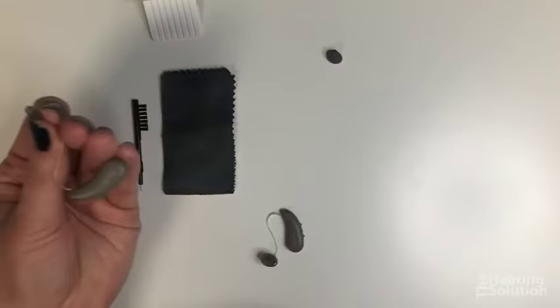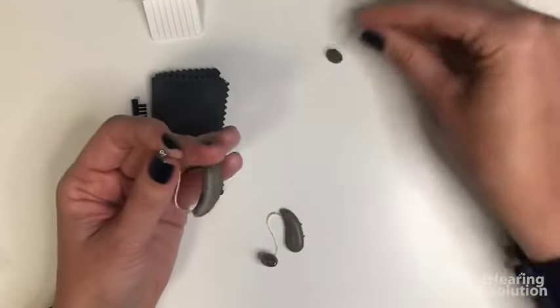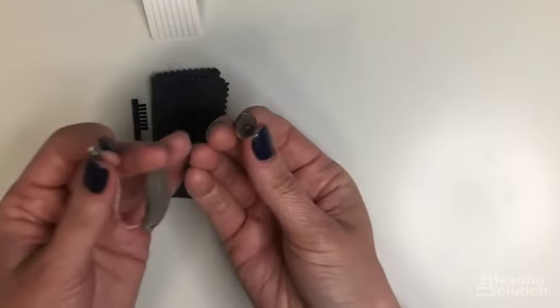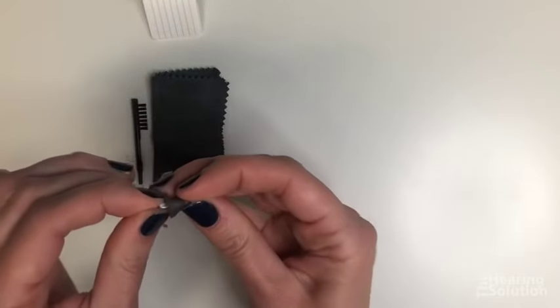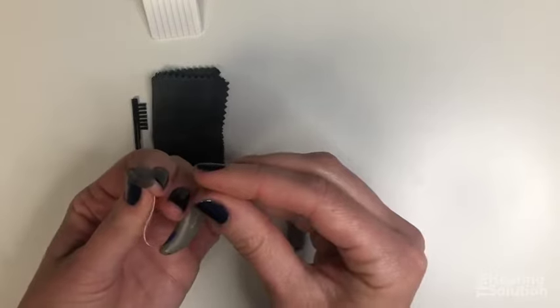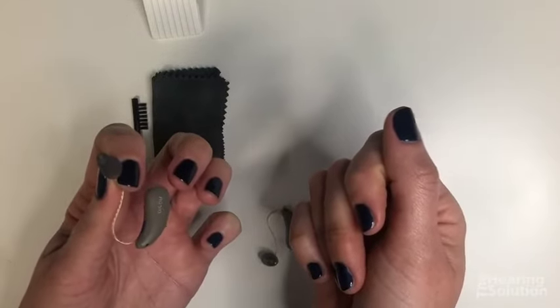Now that this is all clean, and you can wipe down the end if you see any wax, you can put your receiver back into your tip, and you push it pretty hard and you'll hear it click and you'll feel it click on. So that's never going to fall off in your ear, which is great.